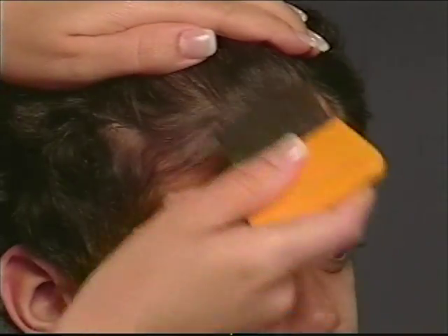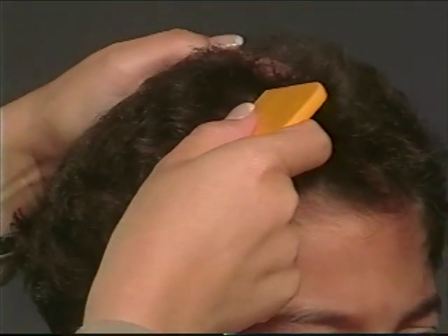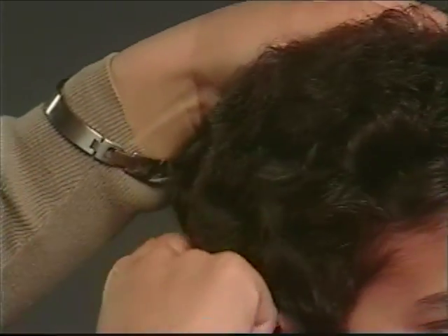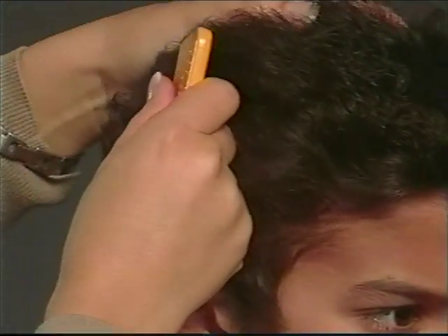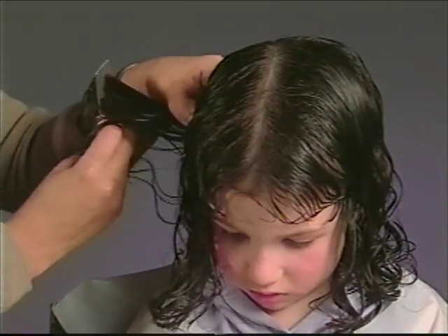Even under ideal conditions, you may miss a few lice or nits. There is no need to panic if the next day you comb out a few. Ongoing combing is a must and removal is always success. That's why regular screening is the best prevention.